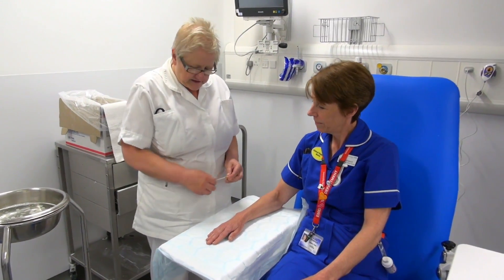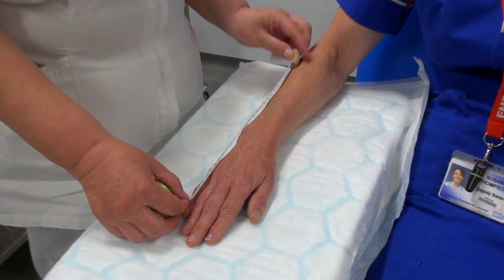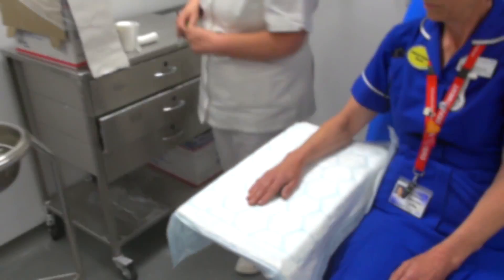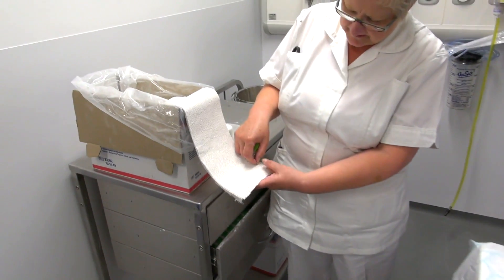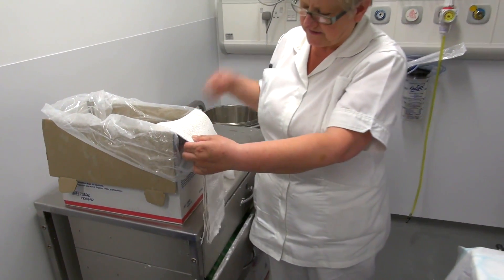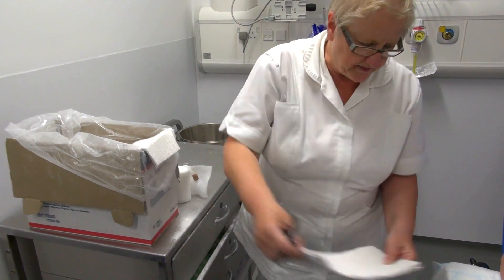Okay Sue, you need to measure from the tips of the little finger to just under your crease. Because Sue's got small arms, we're going to use a 15cm plaster. Anybody with a bigger arm, you can always go up to a 20cm plaster. So you cut it as normal, just one piece.